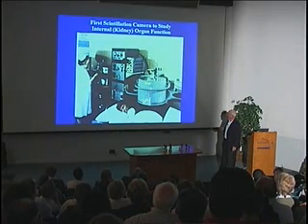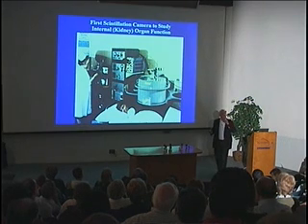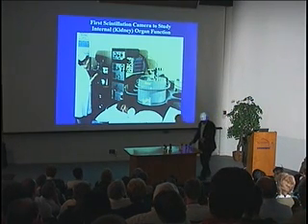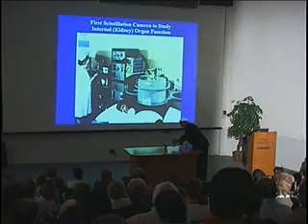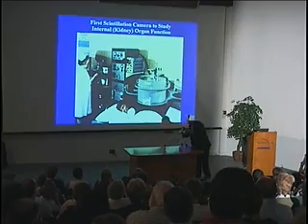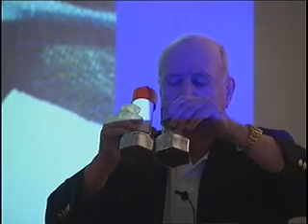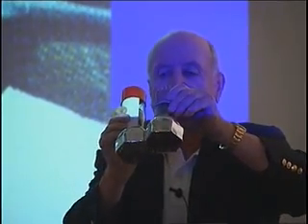And this was a way of making an image. Instead of a Geiger counter measuring how many clicks there is over your thyroid, one could put together a series of these phototubes. Just imagine about 19 of these, or up to 54 of these things, all packed together in a giant circle. Now we have a plate.